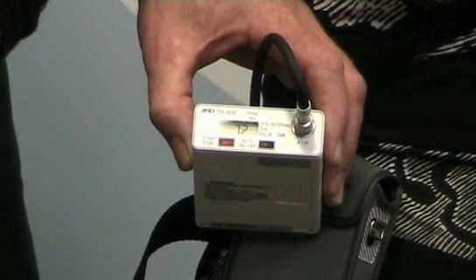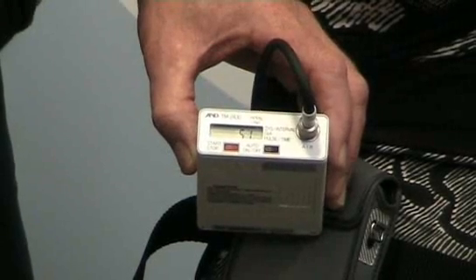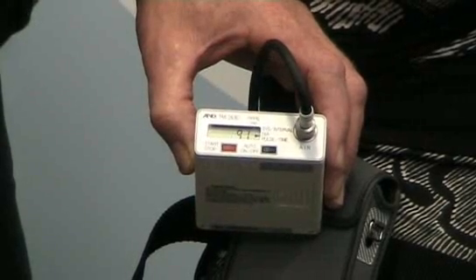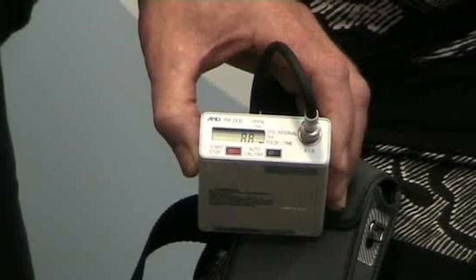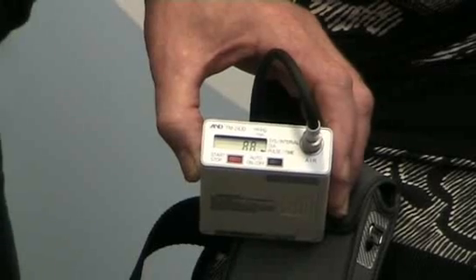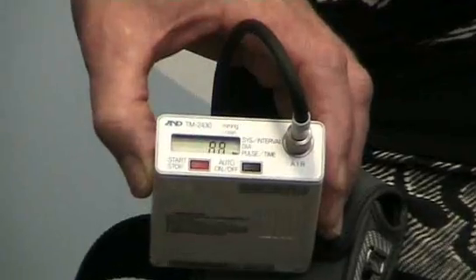The important thing is the patient must remain still and quiet while a reading is taken. As soon as the inflation starts the patient should stand still. The monitor is set for every half an hour and every hour, so the patient knows approximately when it will start to inflate and can prepare accordingly. Once the inflation and deflation is complete, the reading is displayed five or six times and then goes back to the time mode.